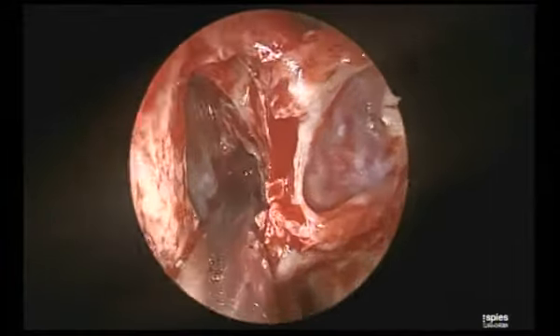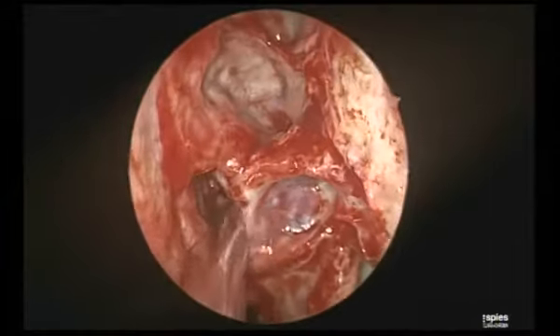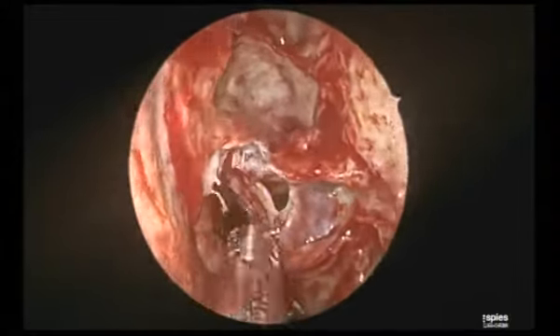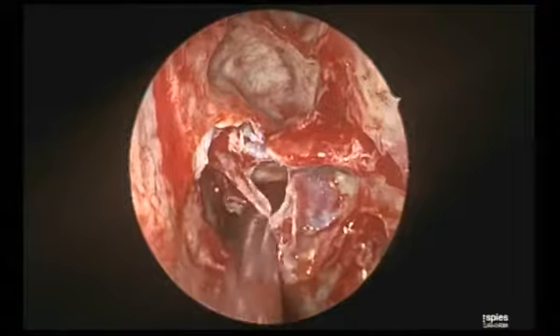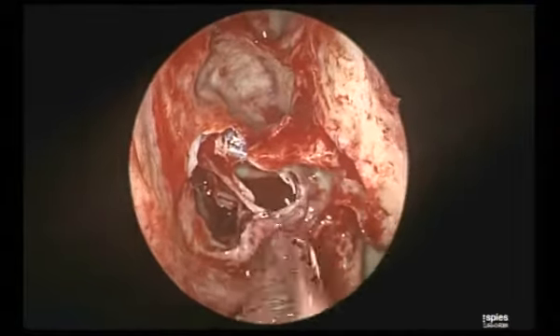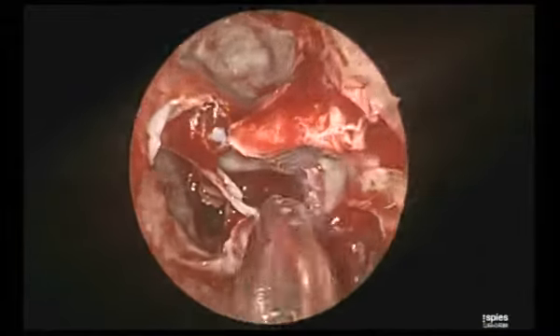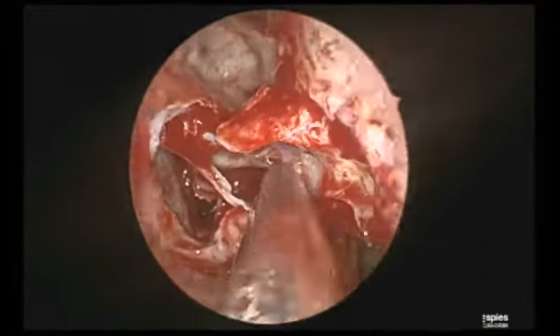Now, once I know my posterior limit, I can take away the posterior ethmoidal cell easily. Now I know as long as I stay anterior to the anterior wall of the sphenoid sinus, I can never damage anything. Perfect. See now, under vision, this is the lamina papyracea.